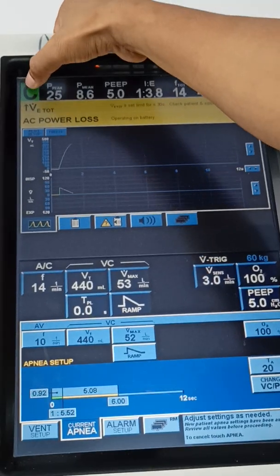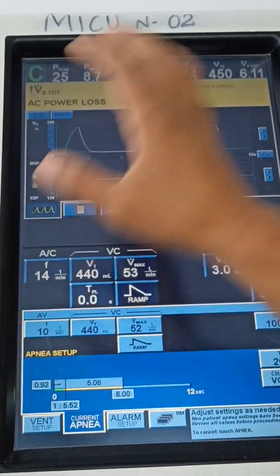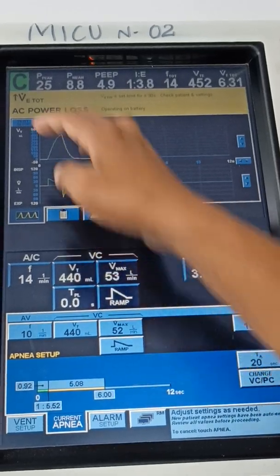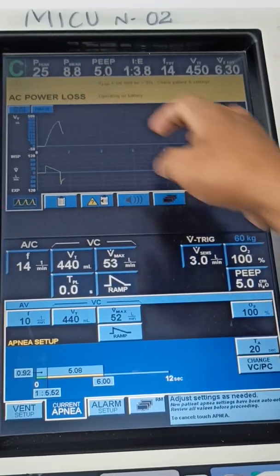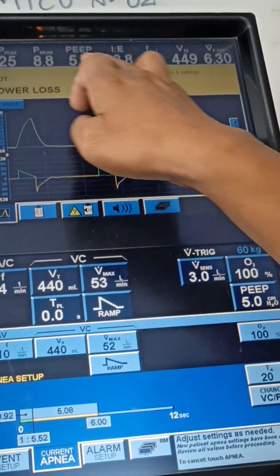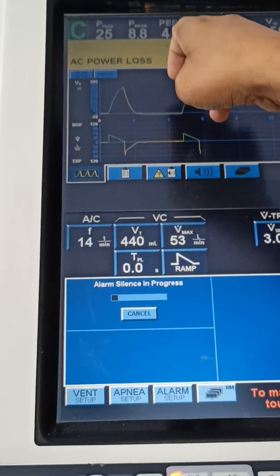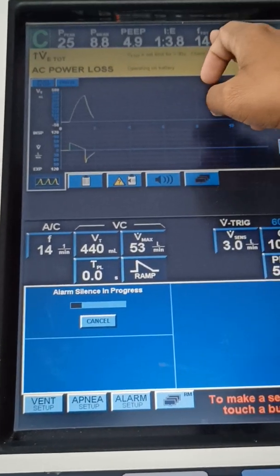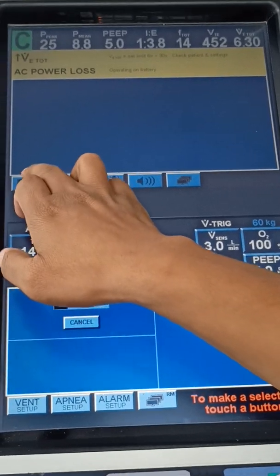On the top you will see the patient values — how much we set versus how much the patient is generating, to check whether it is delivering properly or not. It is showing 'C' — in AC mode, 'A' stands for assist, meaning when the patient initiates the breath the ventilator is assisting. When the patient is not initiating, the ventilator takes total control, so it shows 'C'. Peak pressure should be less than 30. PEEP is set at 5 and coming back at 5. IE ratio and F-total — respiratory rate is 14 and tidal volume is 450.